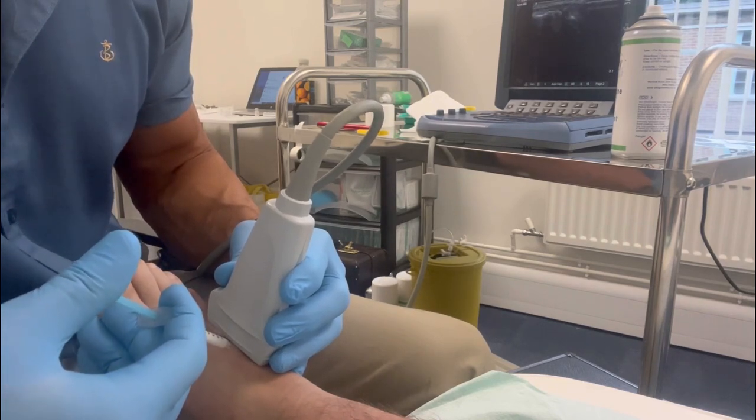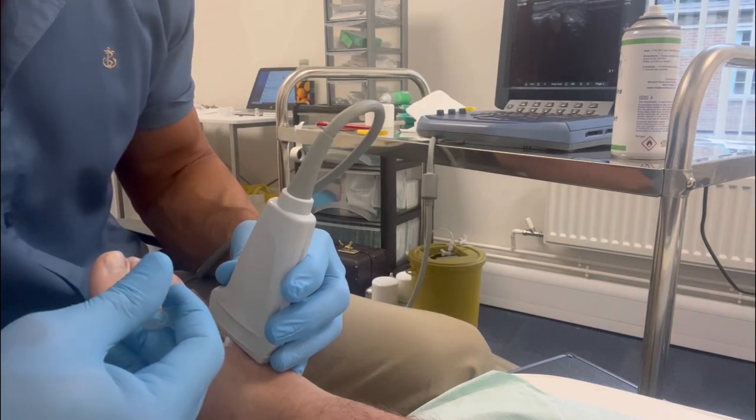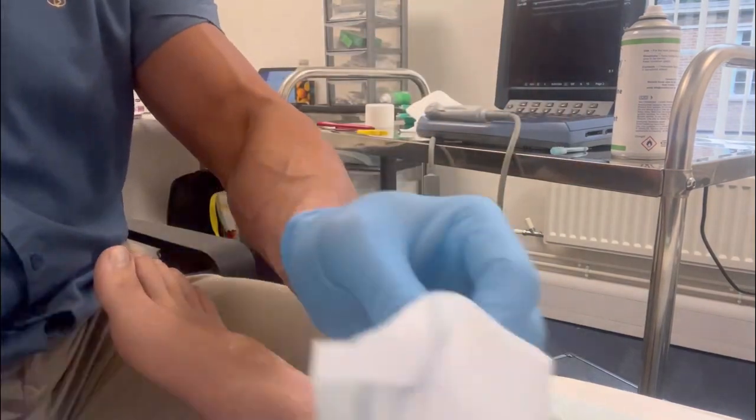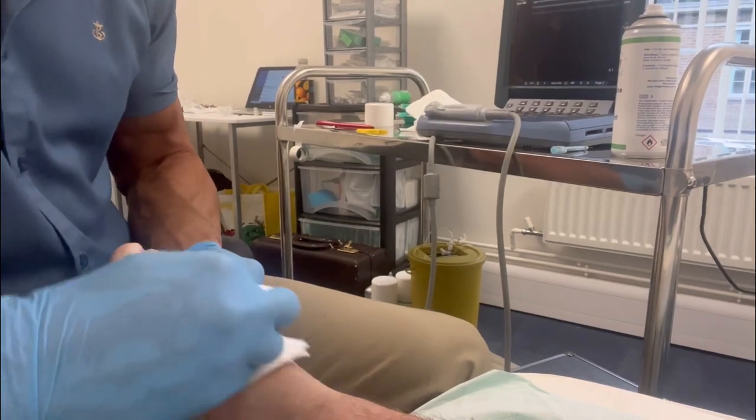You can see on the screen behind just about the needle as it accesses the joint capsule, and the injection is performed perfectly. Hopefully he'll be back playing sport in no time at all.